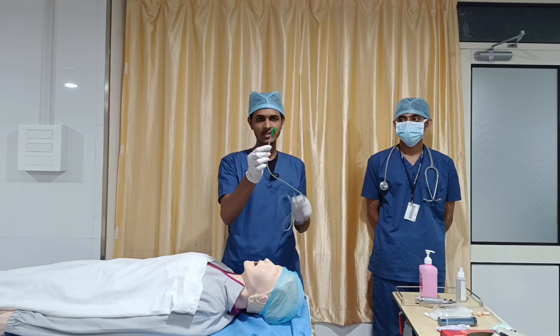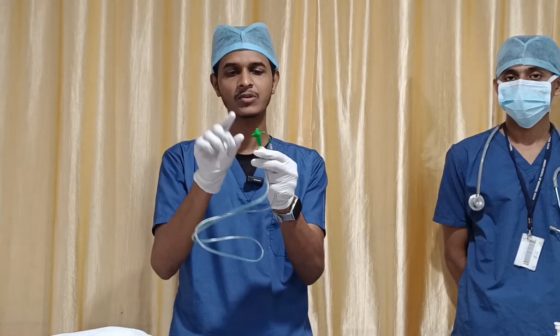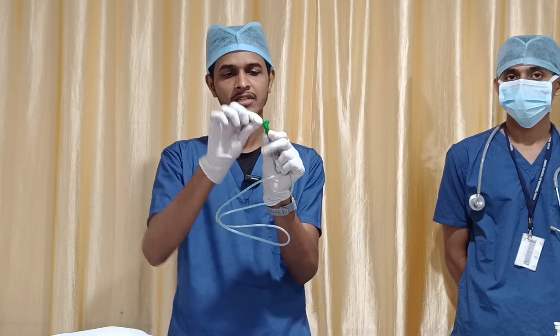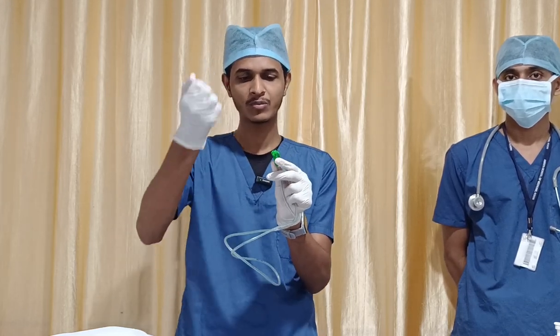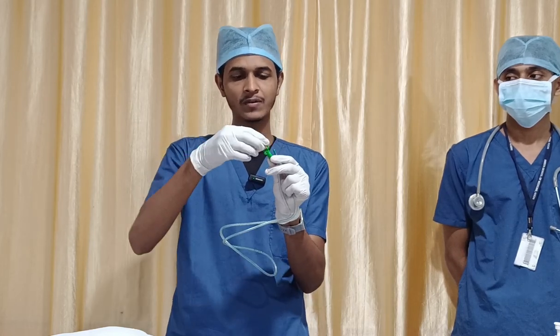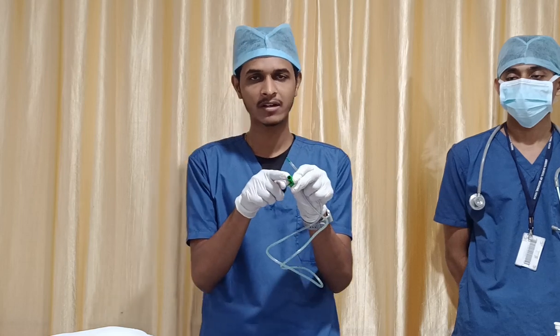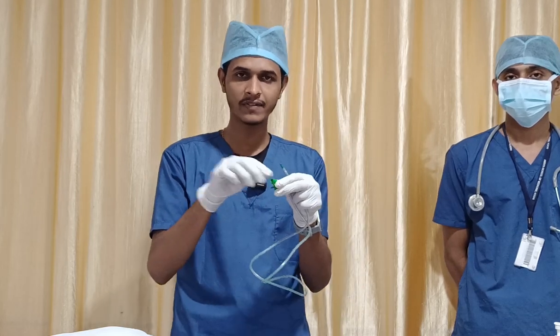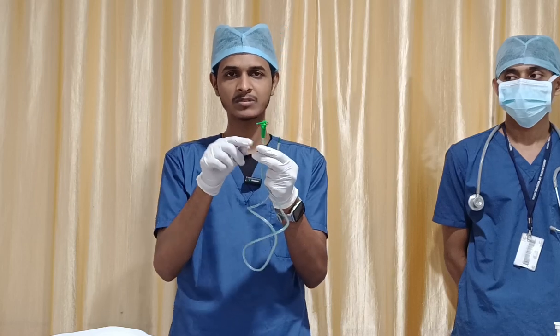This is the proximal region. So this cap, and then you can see that in the proximal part there are two portions. This upper portion is for your syringe. If you have a syringe, you have to insert it in this upper portion. If you have a feeding bag, this port is for the feeding bag, so here you have to connect the feeding bag. So these two parts comprise the proximal region.